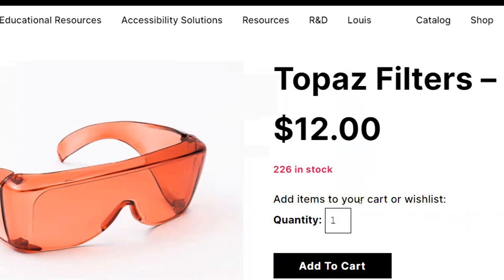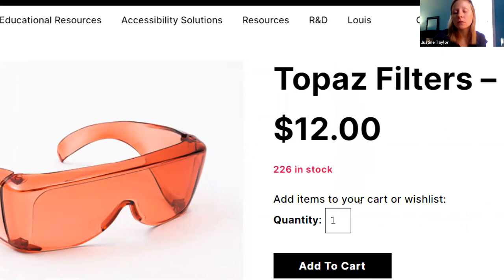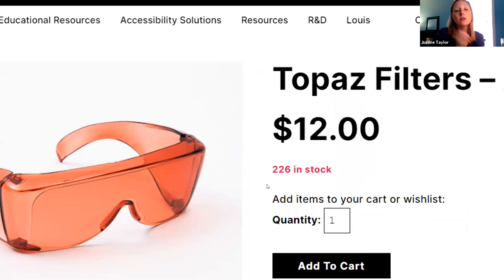Normally there's an assessment that would be done to find out the preference of the user. There are a lot of different eye conditions, and if the individual is photophobic or has albinism, they're going to have a specific preference. So there's not just one color we can say is great for, you know, macular degeneration. We can give a general idea.